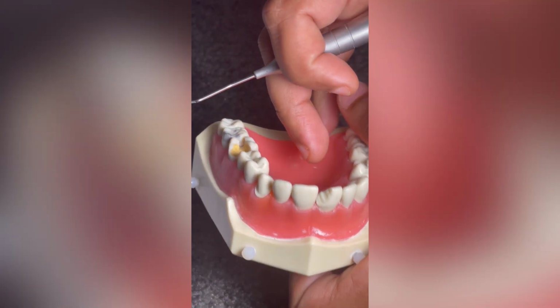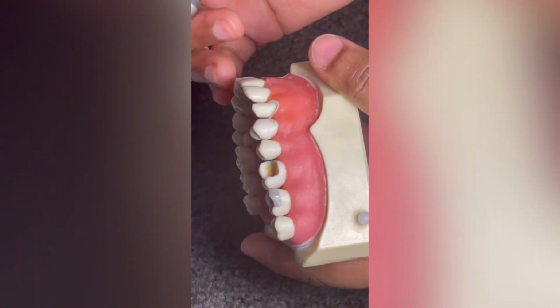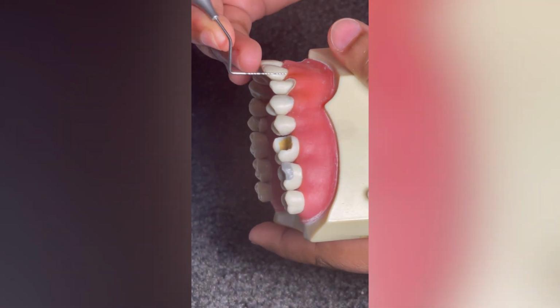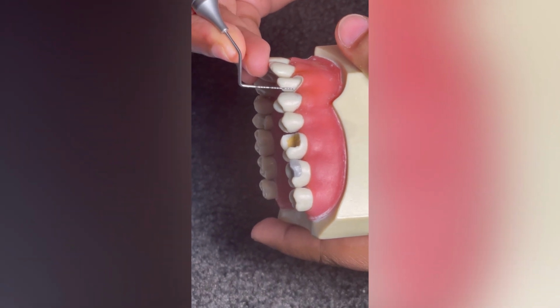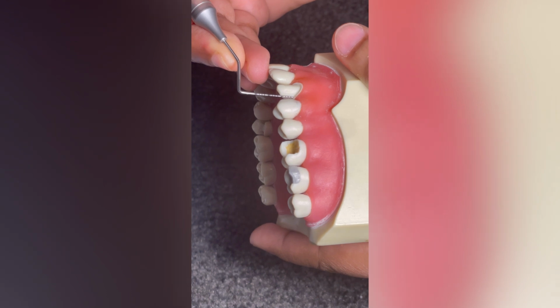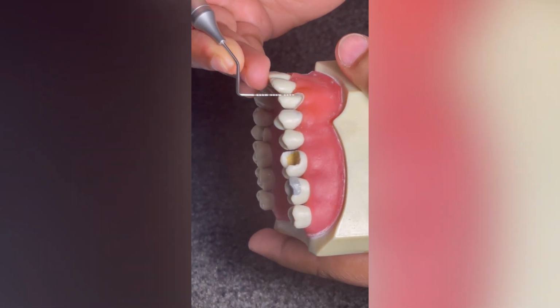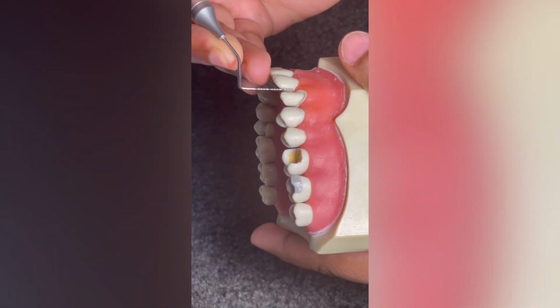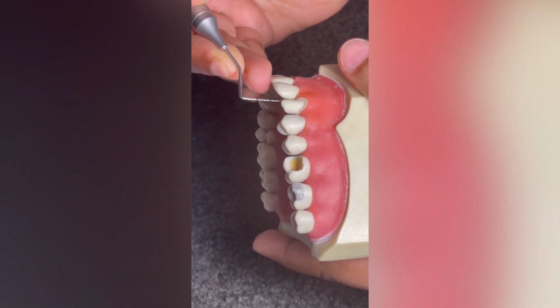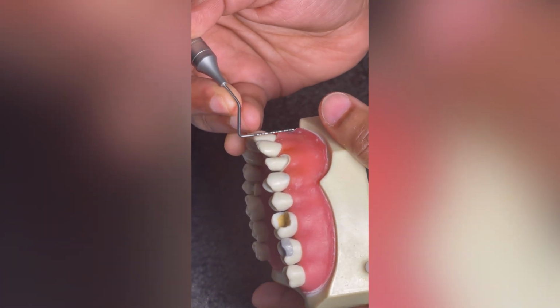And overall preparation taper of 12 degrees, that's very good. The best way I usually check for taper is to put your perio probe right in there, and if the crown is a bit tapered, then that's your taper. It shouldn't be straight, or the other way around, but on both sides put your perio probe, and the preparation should taper a bit, not over taper.